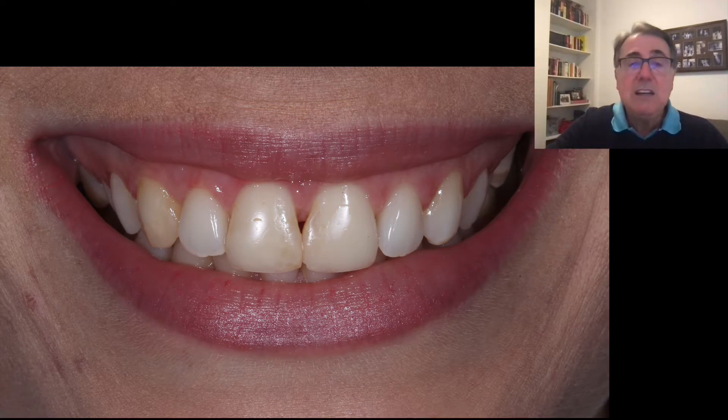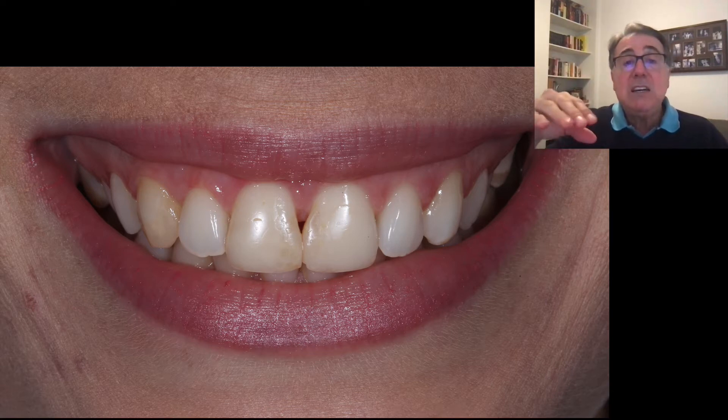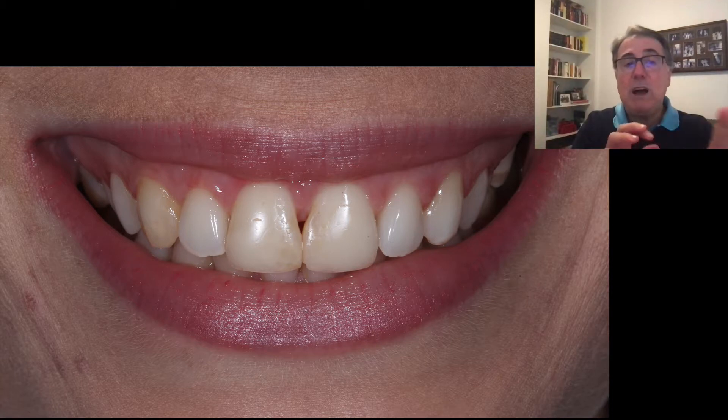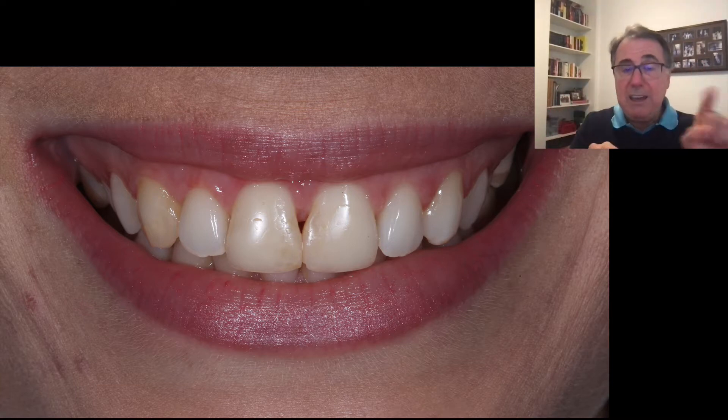This is the case — the patient came to us, she has a diastema that was restored not too long ago, but those teeth were all covered by composite. The two centrals and the right canine also. If you take a look at the right canine, it seems that the tooth is dark, but that's just because of the composite — it's covered by a low value composite, that's why it looks like that. So we're going to restore the two centrals and the canine.